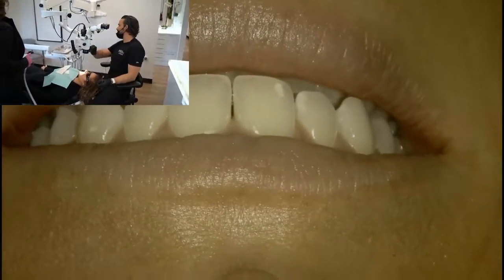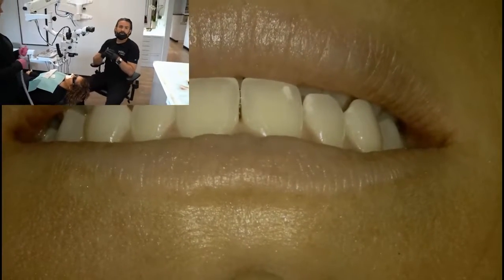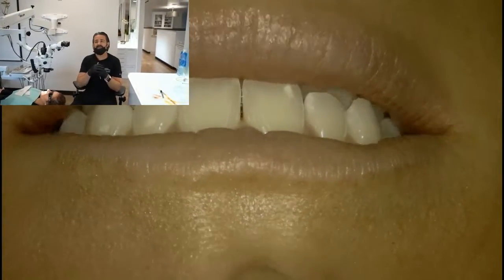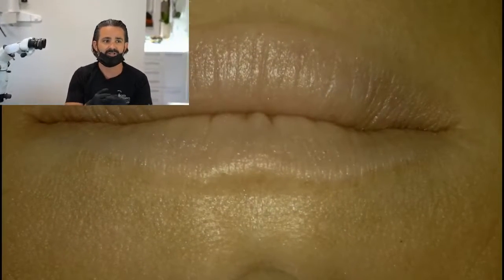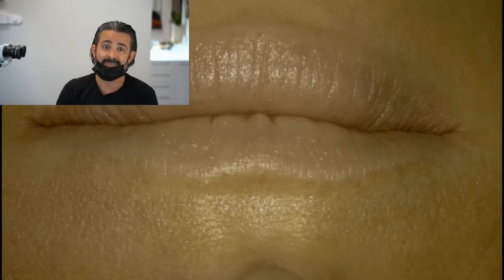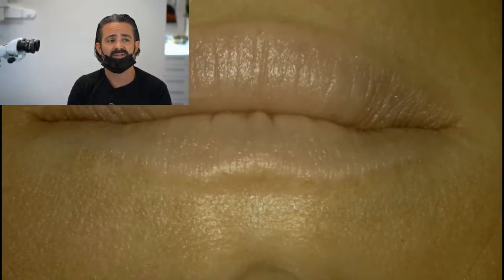Yep, let's hear the question. This is Alex again. He asked, how does the green filter help during endo surgery? So the green filter has to do with blood, right? And when we say surgery, we're looking at periosteum. I want to look at a PDL, a microfracture. I want to find the foramina of a tooth or a lateral canal. So it's really in that surgical space.